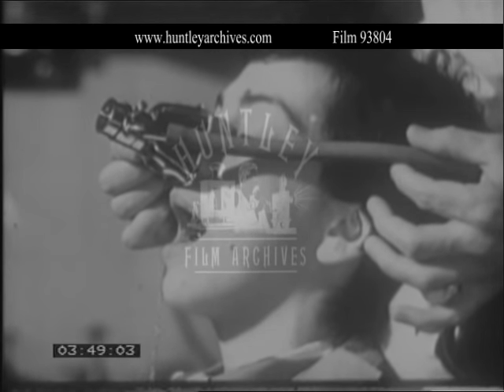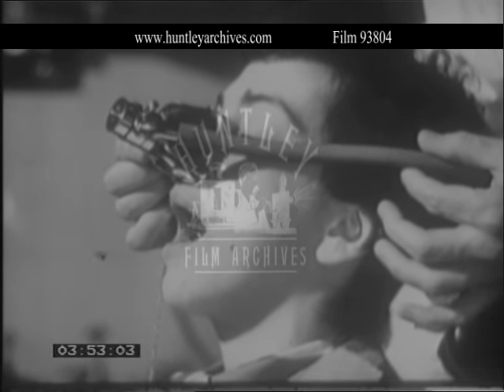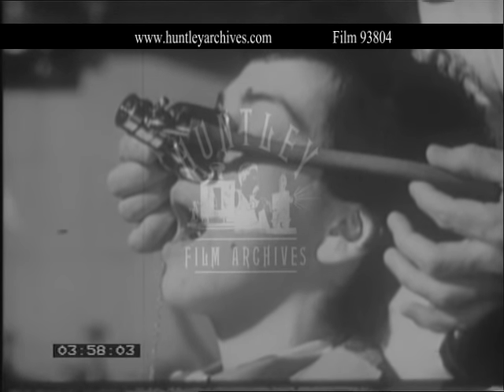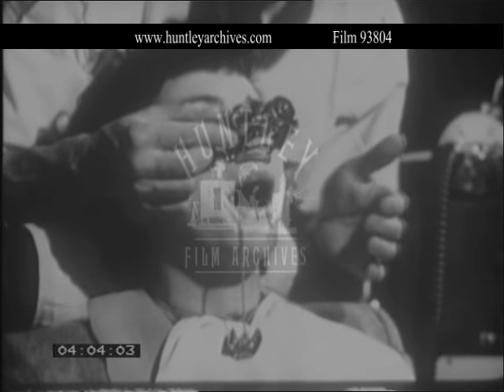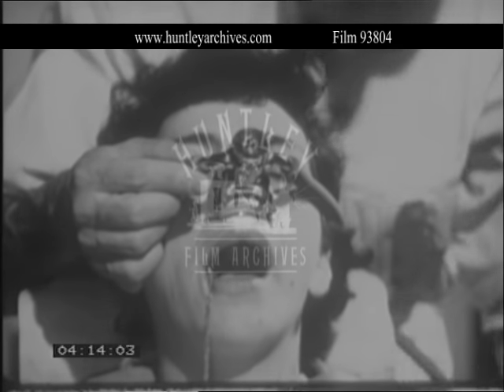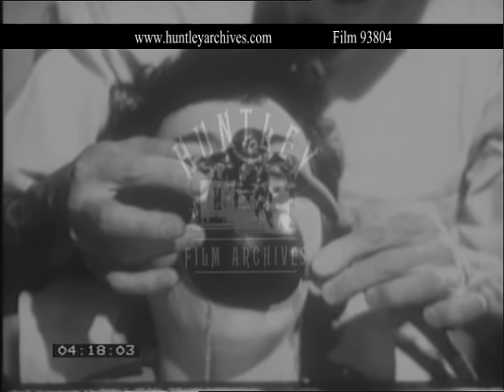Only when analgesia is present is the nose piece allowed to come in contact with the face. If the patient reverts to mouth breathing, try further encouragement and suggestion by resting your hand near the mouth. Mention that whilst your hand is there, the dental surgeon cannot start. If persistent mouth breathing occurs, a mouth cover with a supply of gas should be used.